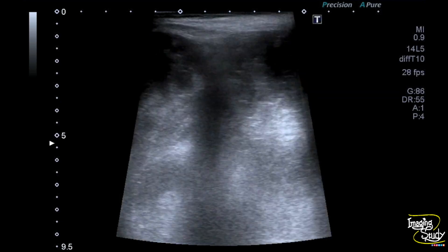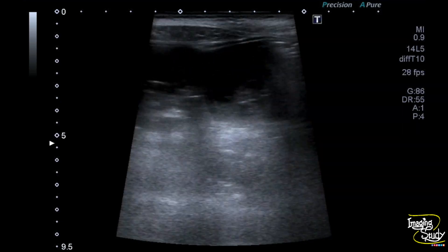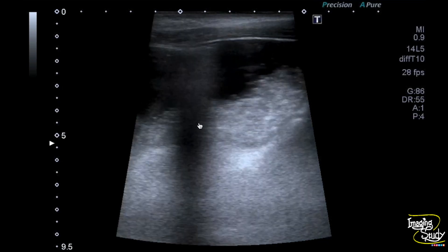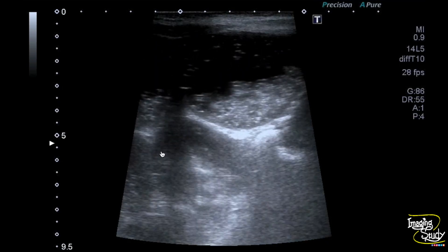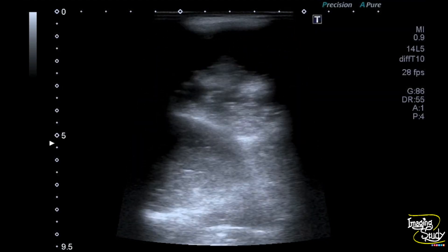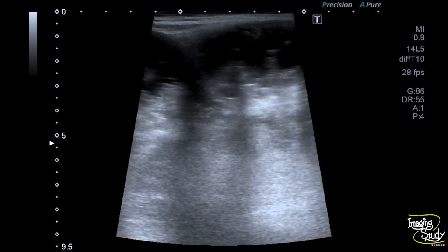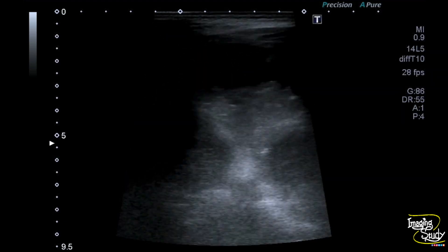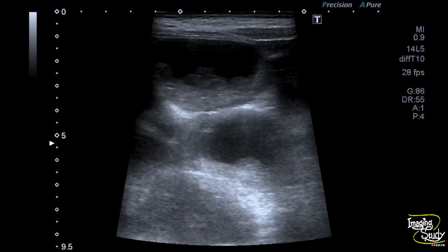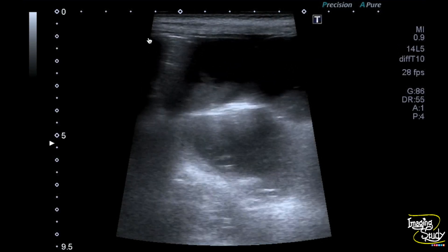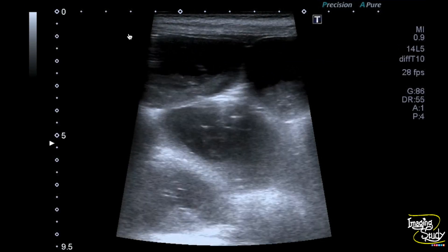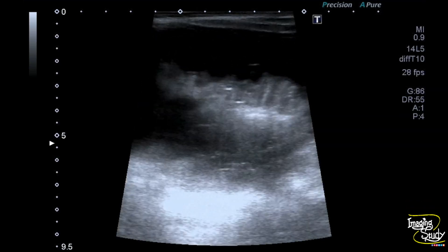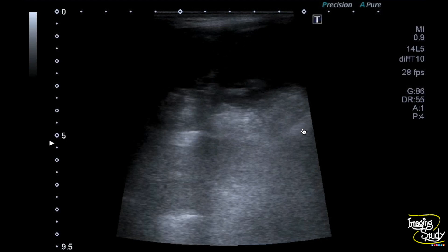Here you can see a distended intestinal loop with a high frequency linear transducer. You can see the movement within this fluid-filled bowel loop. These fluids are moving forward and backward, known as to-and-fro flow. These are the bowel walls and you can see the gut signature is maintained here. These are the valvulae conniventes, indicating it as a small intestinal loop.